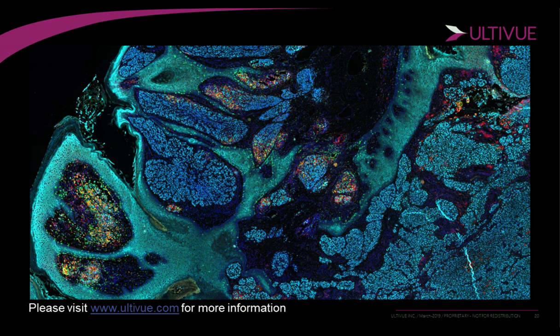So for swapping fluorophores, that's not something we typically do. I mean, we pick the fluorophore specifically just to make sure that there's spectral isolation, so you don't have any bleed through or crosstalk. With our Axio Scans, all our Axio Scans here that we run are actually Cy7 enabled.